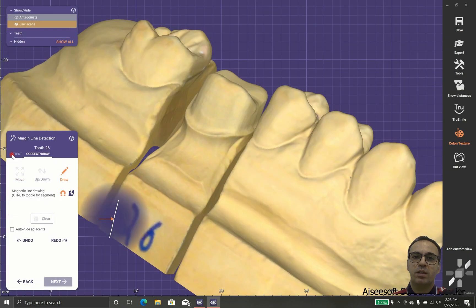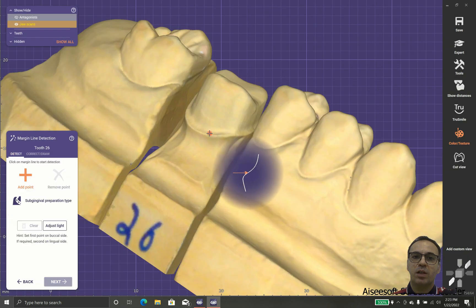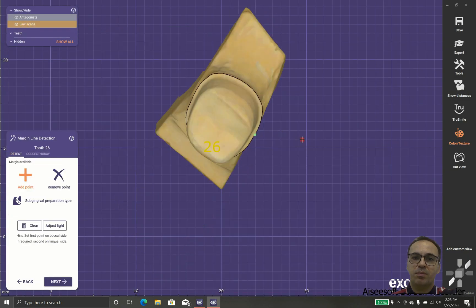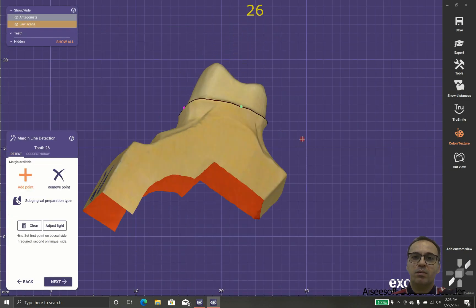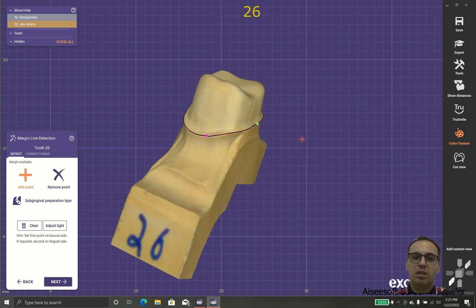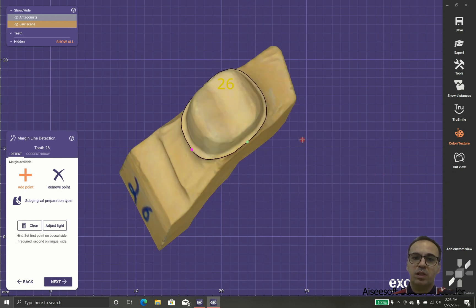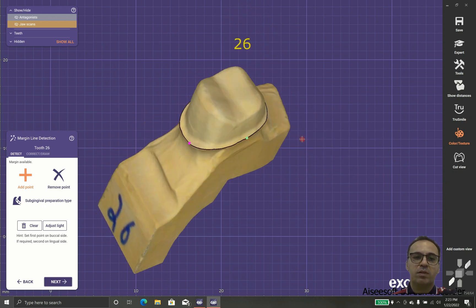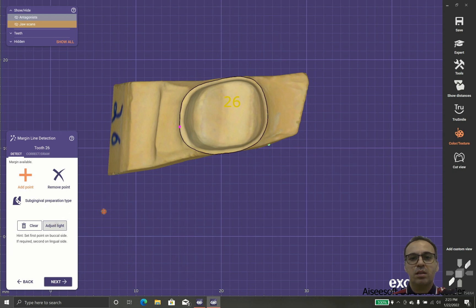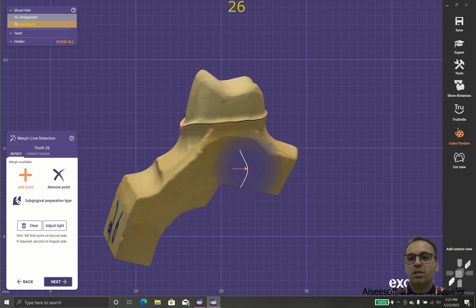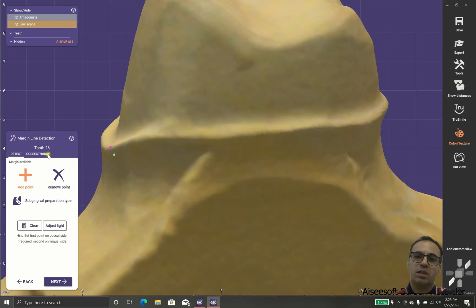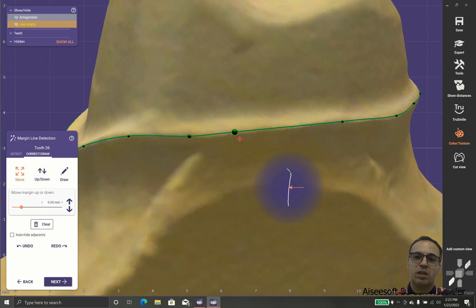So this is correct and there are no... We clear it and we are going to detect. I prefer to use detect in case that the margins are clear.